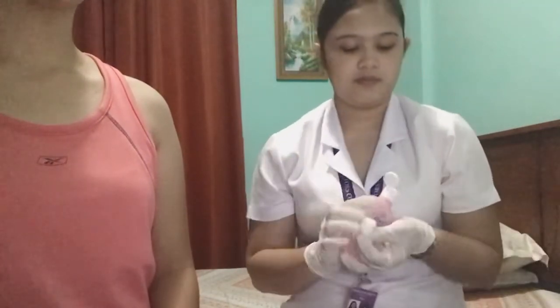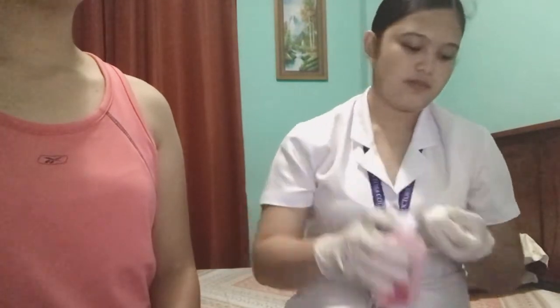Place the patient in a comfortable sitting position, then ask the patient to relax the area that you are about to inject. Okay, Ma'am Dayan, I need you to relax your arm as well as yourself, okay? Okay, nurse. So, don't forget to apply clean gloves and clean the site with the antiseptic swab in a circular motion, starting from inner to outward.